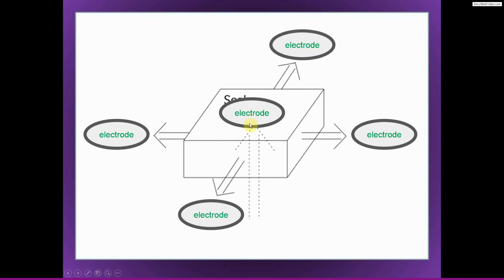So imagine we have just 5 electrodes here, and what we want to do is eliminate or attenuate the volume conducted artifacts that are shared across all of these electrodes. One way to think about this is that any activity that we see equally well at all of these electrodes is going to be activity that is shared across all the electrodes, and that is going to reflect volume conducted activity.